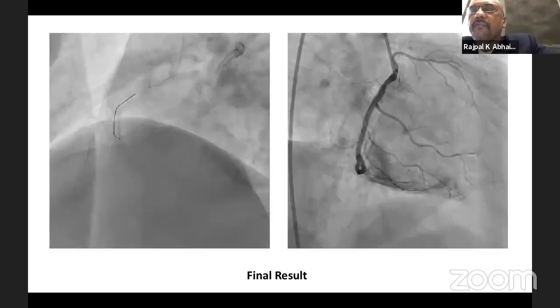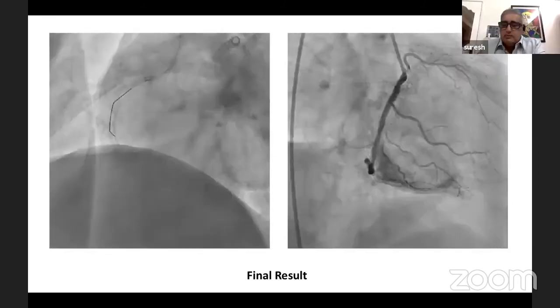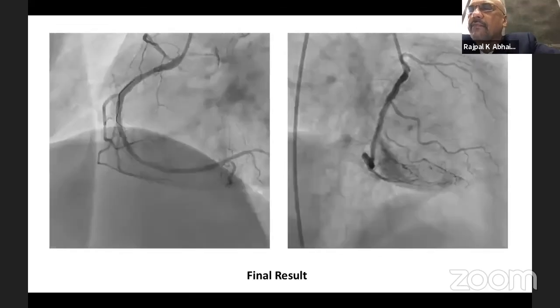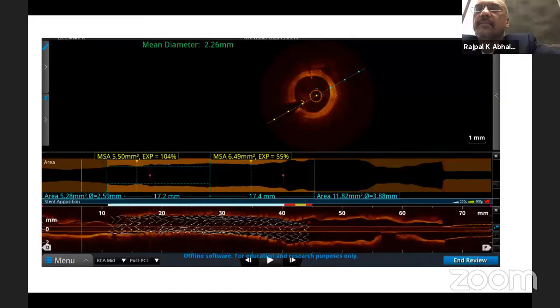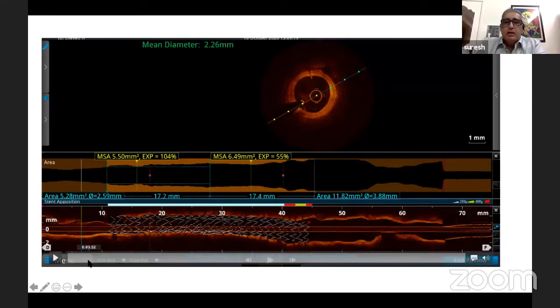I was just wondering if you could show us that OCT run again. Which one? I absolutely agree with you. It's a wonderful result. And could we look at that OCT run again if it's possible, Dr. Suresh? Of the RCA? Yes, of the RCA. I'll go back and see. Please. Yeah, that's the post. Yeah, no, the pre. Okay, let me just get that.